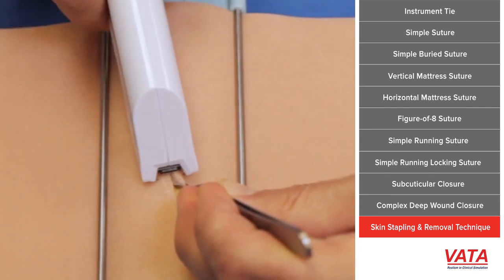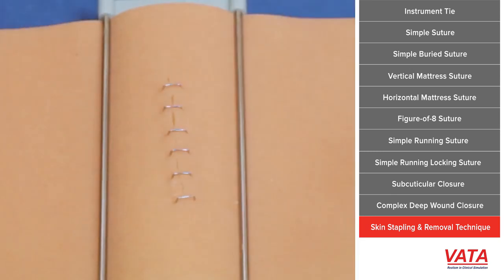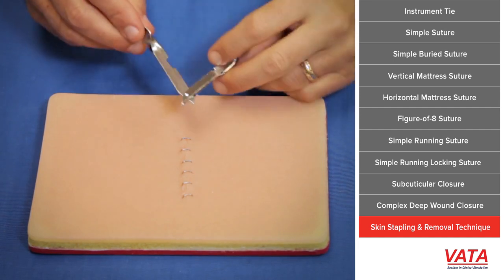In a case like this, if this were a complex wound with multiple layers of closure, a staple might be nice because I'm going to leave these staples in for a few weeks. Generally, where sutures can get infected, metal staples do not.